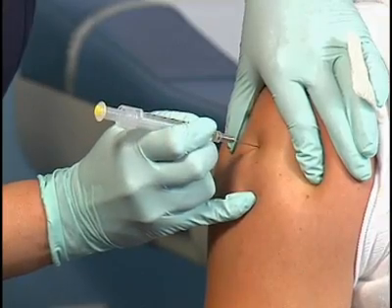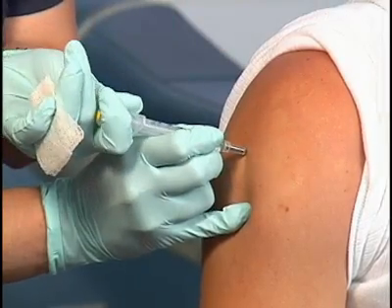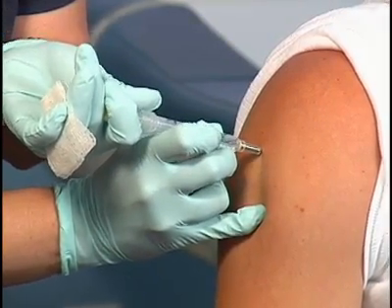Wearing clean disposable gloves is an important part of hand hygiene and one of the most effective ways to prevent the spread of infection in the medical office.